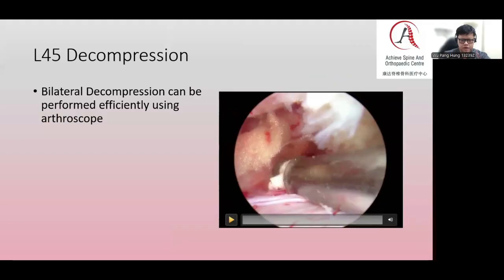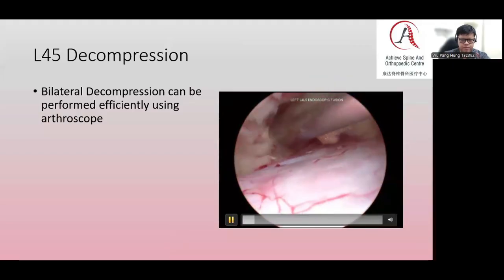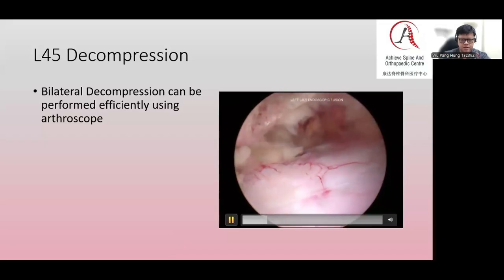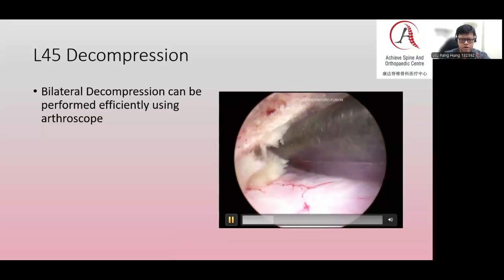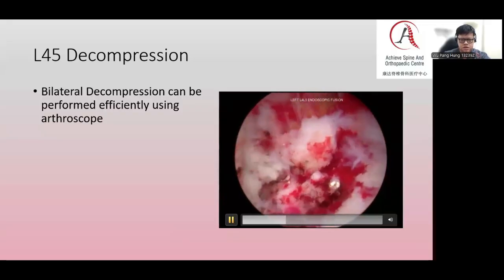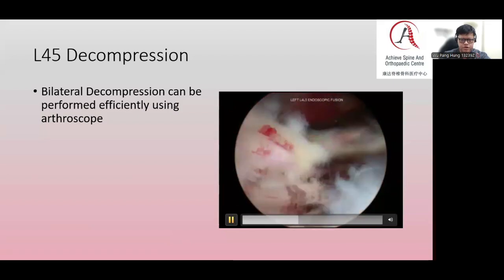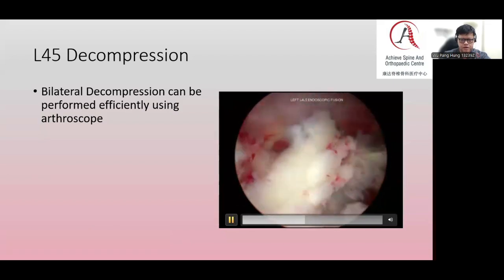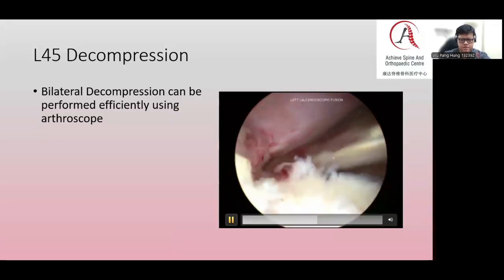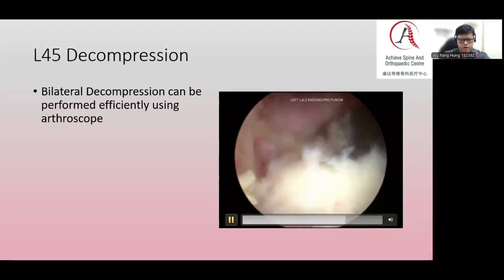As you can see earlier on, there is severe spinal stenosis, so we do a thorough bilateral decompression. These are the contralateral lateral nerve roots, and at this space you can see good decompression was performed. Now, after we have done the decompression, we can do a superior articular process resection and remove the remaining flavum on the left, ipsilateral side. After the flavum is removed, we can see this space quite clearly.